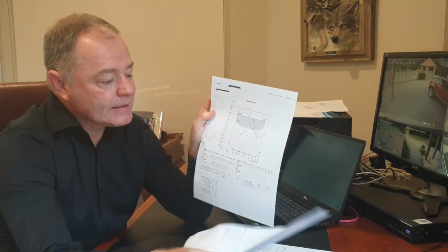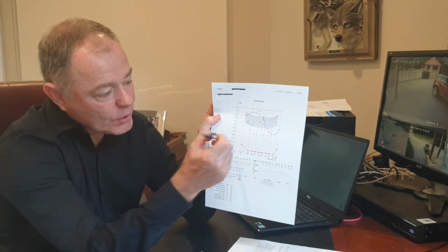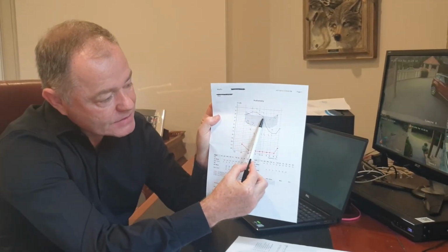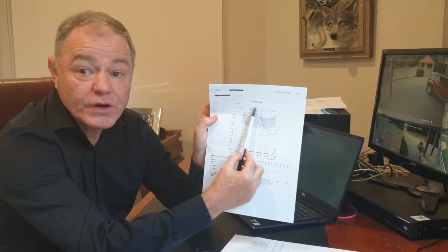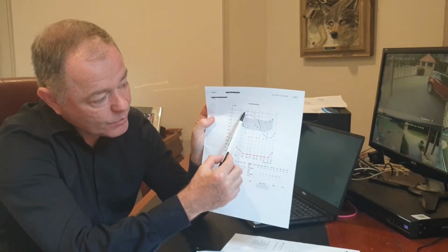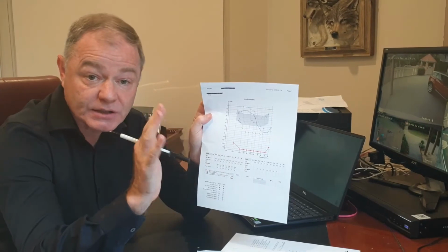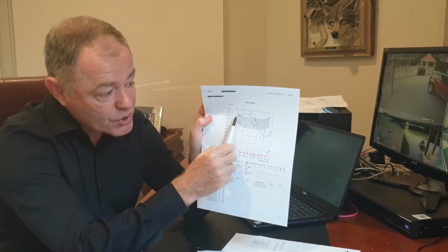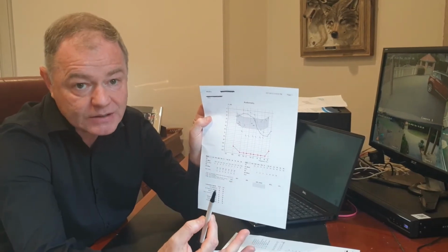Okay. And then in this scenario, this final one, if we have a look firstly at the left ear, this is a hearing loss where the low frequencies are good, the high frequencies are bad, and the bone conduction shows us that it's a sensory neural loss. It's the little nerve endings that are damaged. This person has no option but to wear a hearing aid in that left ear if they want to hear better.